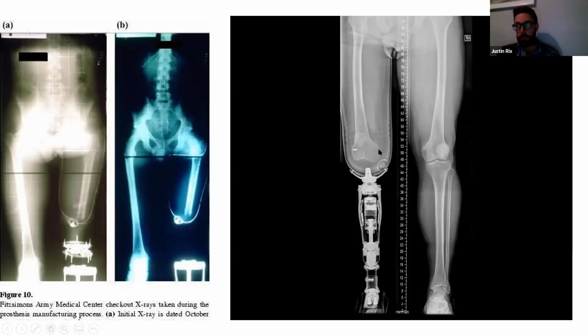Although this amputation allows the user to end weight bear, it has its drawbacks too, where we have our knee center much lower on the prosthetic side than on the sound side, which makes the aesthetics a little bit tricky for the patients, as the knee will stick out a little bit further. But the prosthetic advantages outweigh the disadvantages in this case. So we've spoken about the bone, we've spoken about the bone length. So now we go onto the skin.